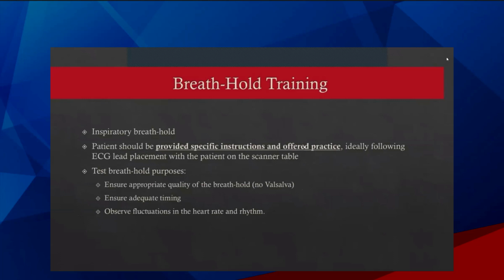Also, we try to make sure that we put the leads on first, because we really want to see what the heart rate does when they hold their breath. Generally, most patients, when they're holding their breath, the heart rate will lower, but you want to notice that pattern to see how much it does lower.